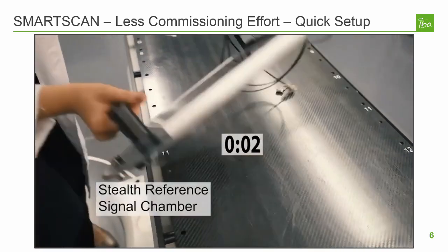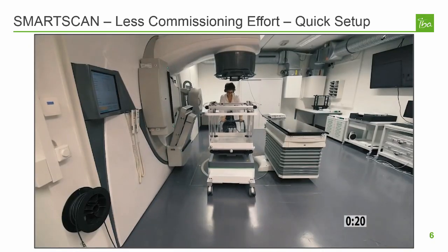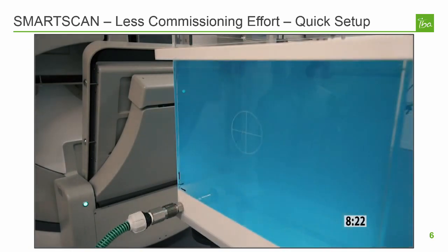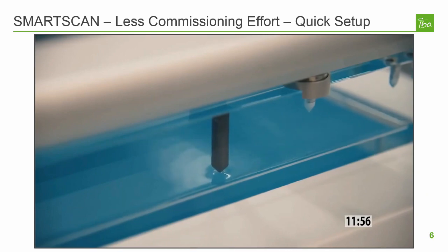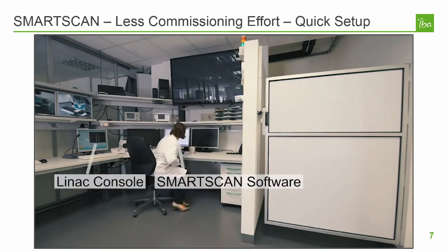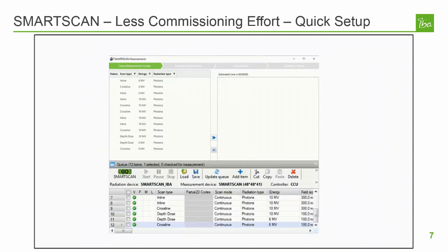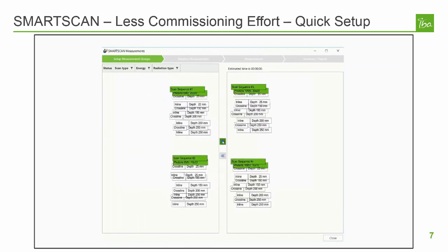Setup begins with the Stealth Reference Chamber that mounts to the linac head or the top of the water phantom in seconds. From the time you wheel the water phantom into the room, setup can be finished in about 12 minutes. Tank leveling is accomplished with leveling pins located in each corner of the tank; the user adjusts the corresponding mechanics leveling screw until the pin just breaks the water meniscus. Field and reference detectors are connected to the connector box mounted on the side of the tank, eliminating the need to run long cables. Once the phantom is set up, the next step is to load the scan queue. The proper configuration of scan speed and adaptive step spacing can save time and help ensure noise-free scans, and the order of scans is optimized to minimize room entries or machine settings changes. SmartScan software does all of this automatically.